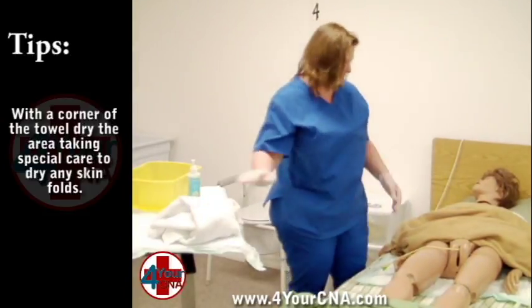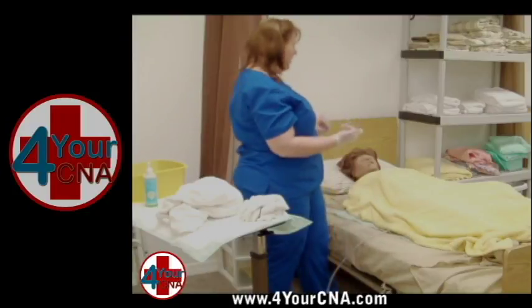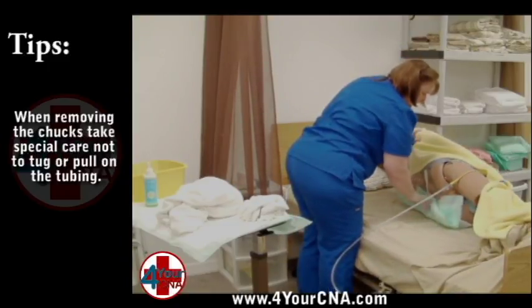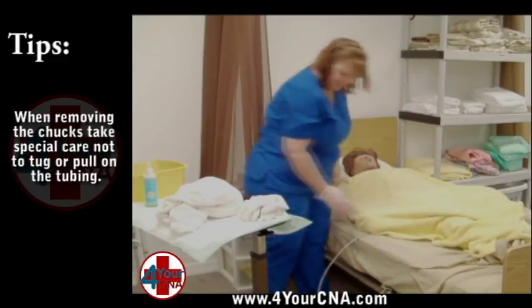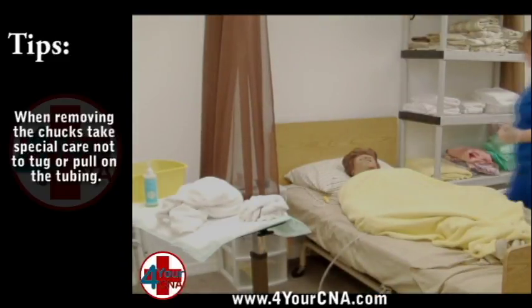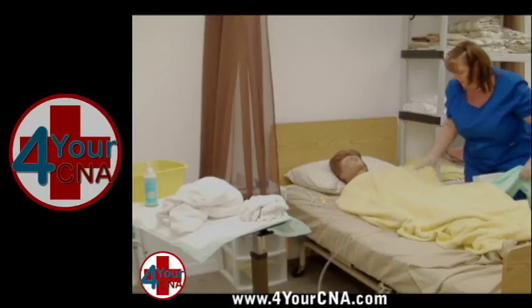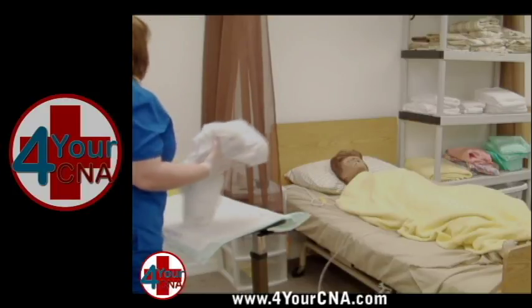Remove the towel and replace the privacy blanket over the patient, taking care not to touch the patient's gown with your soiled gloves. Assist the patient to scoot toward you and roll the patient onto her side in the center of the bed with her back facing you. Roll the soiled chucks toward the patient and tuck it under the patient's hip. Assist the patient to roll back onto her back in the center of the bed. Move to the other side of the bed, scoot the patient toward you, and tilt the patient up to remove the soiled chucks. Return the patient to her back in the center of the bed. Throw the soiled chucks away. Gather the soiled linens and place in the dirty linen hamper.